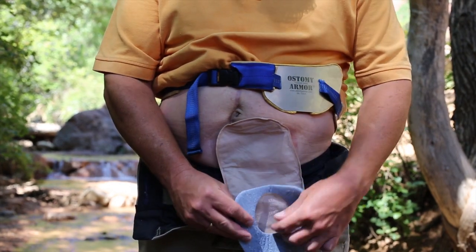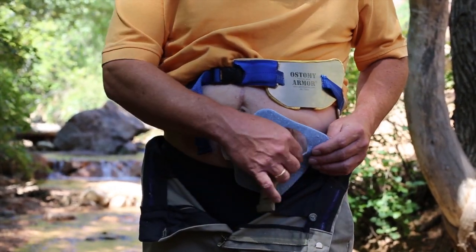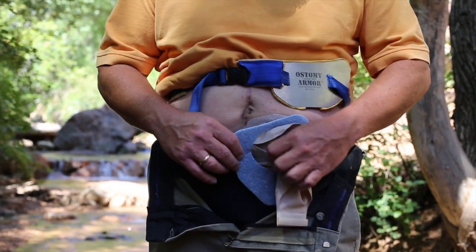Gently work the end of the bag through the opening in the new wick. Work it up and around the bag until the wick is completely between the barrier and the bag.